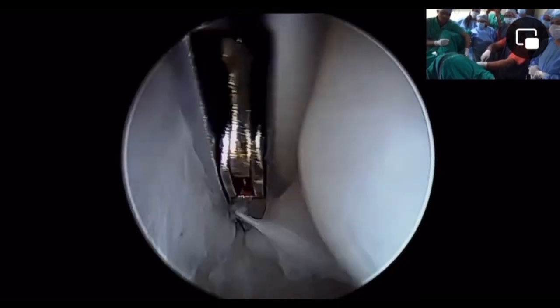If you go very deep, you're cutting into the myometrium, and then you will meet a yellowish structure, the bowel and the omentum. If you're going more anterior, you will be cutting into the myoma itself. So it's all about how to identify the capsule. That's what you're seeing now, the capsule. So I'm very happy to reach the proper plane and then cut and elevate. Now you can see the capsule much better.